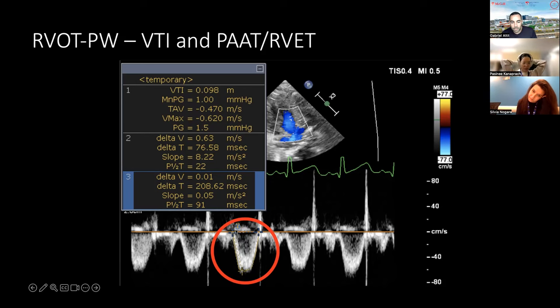Then I get like 5 centimeters per second. Then I get like 10 centimeters per second, and so on. Then I get to like about 60 centimeters per second. And I take the sum of all of that, but multiplying each time by the time. So this is like 0.1 second, 0.1 second, 0.1 second, 0.1 second. And so if you do a velocity times a time, it gives you a distance. And if you do the addition of everything, it gives you the overall distance. And then you take the average of that. And then the average is expressed in a distance.